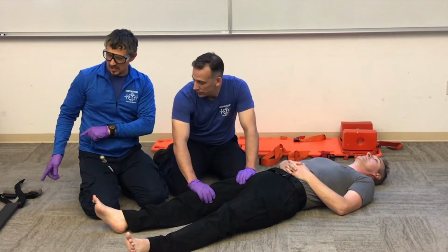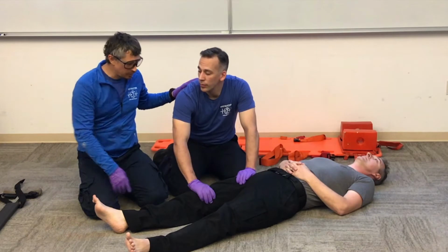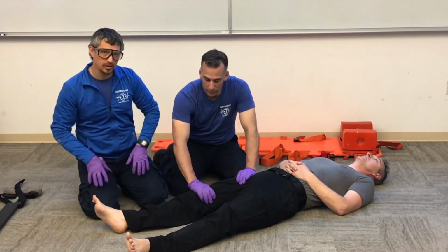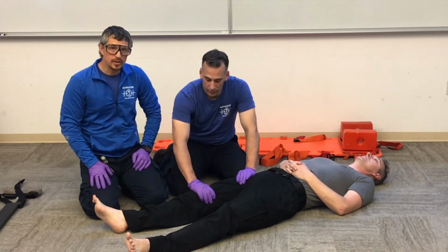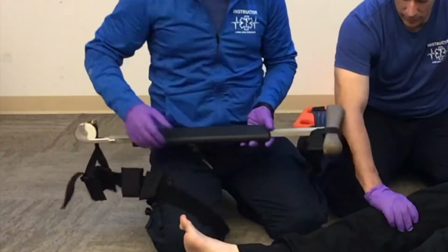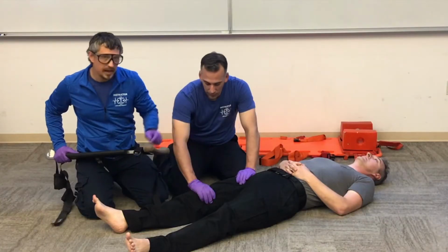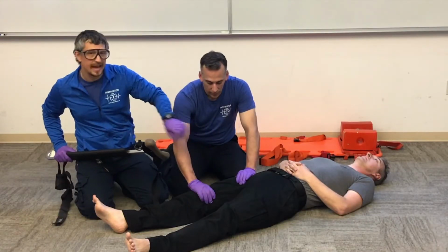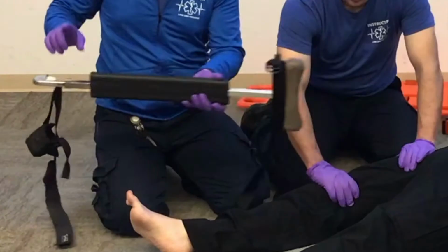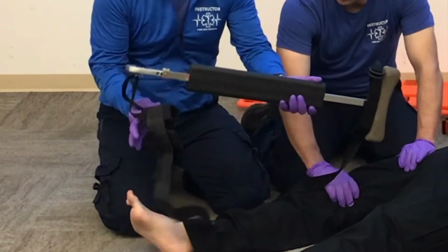A device such as the Sager or KTD, we can leave the leg in place, have our partner hold our manual stabilization, apply the device, and then pull our traction. So today we're going to show you the Sager. The Sager looks kind of like a crutch. It's going to have a piece that's going to go high and tight into the patient's groin, and that's going to be the anatomical feature that keeps our device from moving up. And then on the other end is going to extend down with an ankle hitch.